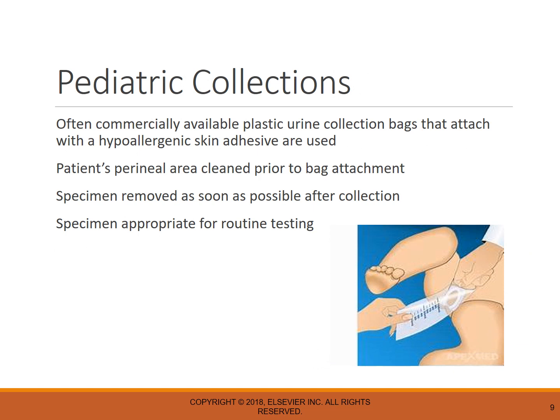Pediatric collections. Newborns, infants, and other pediatric patients pose a challenge in collecting appropriate urine specimens because they are unable to urinate voluntarily. There is a commercially available plastic urine collection bag that is hypoallergenic and adheres to the skin, that can be used.